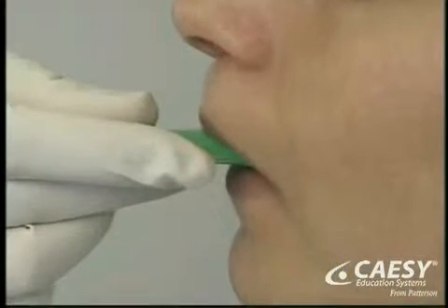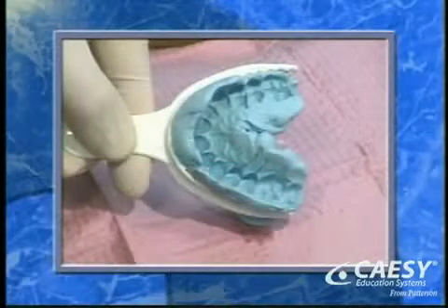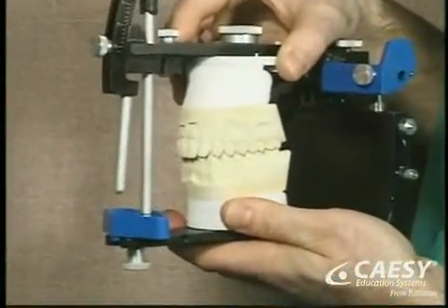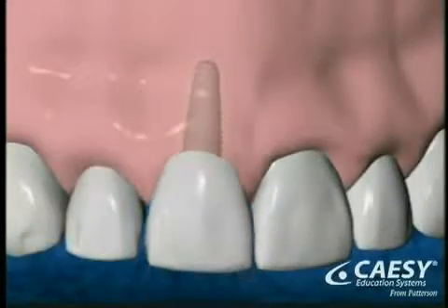We then start a series of appointments to make your new teeth. Though some of the steps might be different in your case, they usually include making impressions of your mouth. From these impressions, we make precise working models of your mouth which are carefully mounted for proper alignment. The last step is the placement of your new crown.